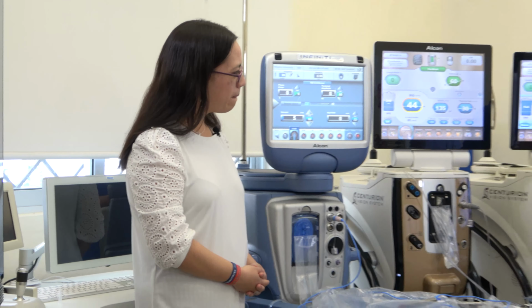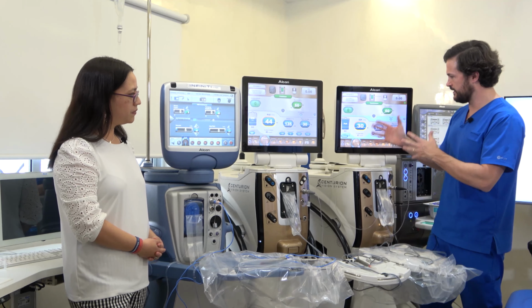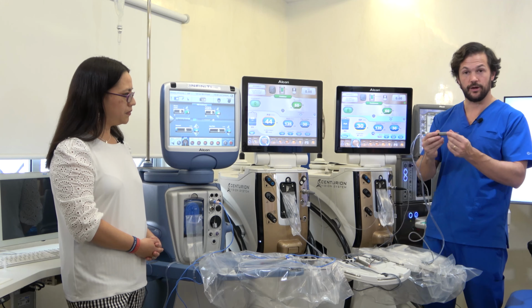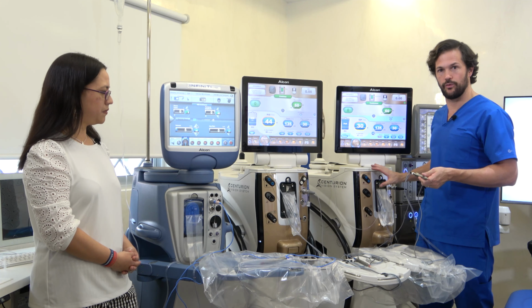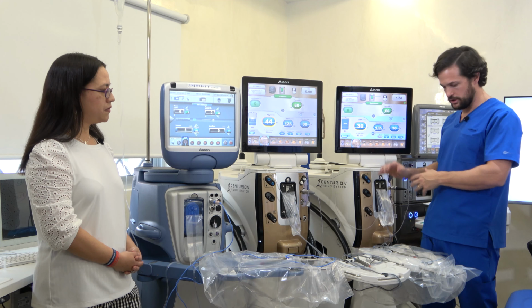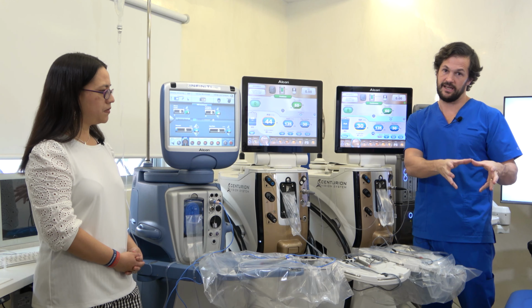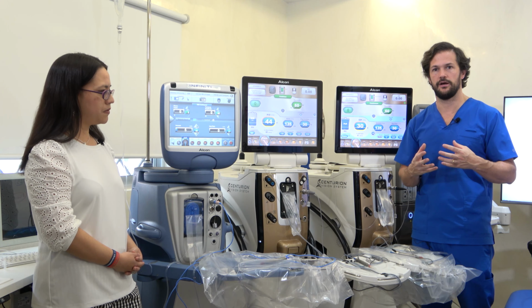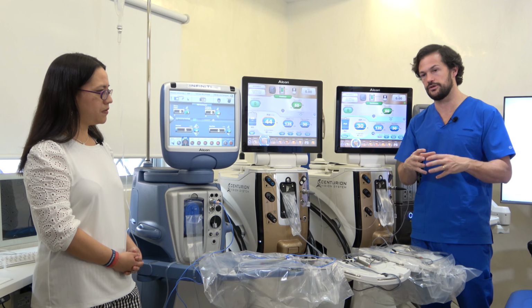Excellent. So the next big step of the evolution was the Centurion system with Active Sentry. And as you can see, and we said before, the handpiece is going to change. You're going to have new software and hardware inside the machine. And what you're going to have is a sensor in the handpiece. So that sensor is going to be like it is in the anterior chamber. So the response velocity is going to be much higher. And now you have more control again of what is important, that is the anterior chamber.